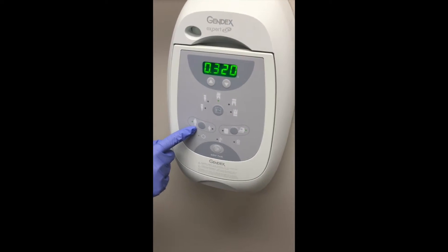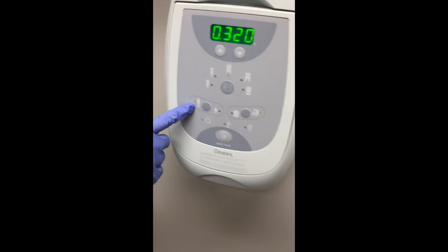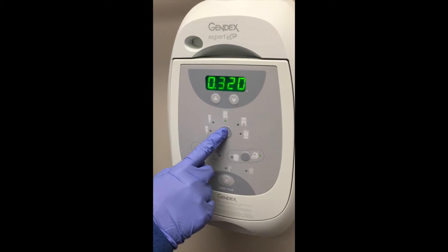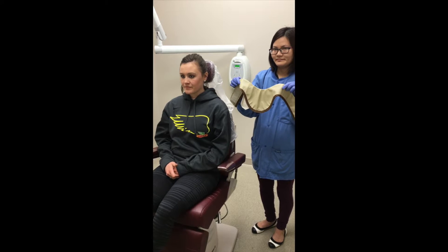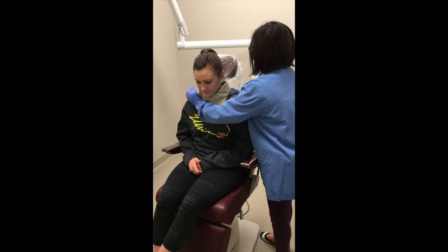Start out by choosing the proper selection for adult or child, then make sure you have the proper maxillary incisor mode selected. Then place the thyroid collar on your patient to protect them from any extra radiation exposure.